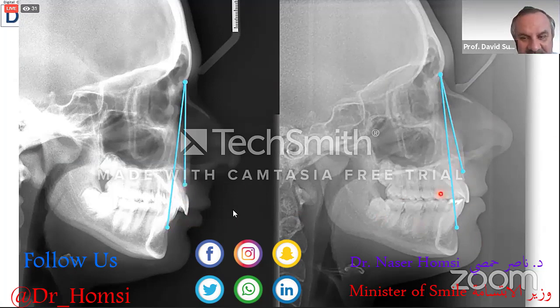Intrusion of the upper incisor with the stainless steel curve of Spee, protrusion of the lower incisor. If you produce protrusion of the lower incisor, and remember in many techniques like the miraculous brackets, passive self-ligating brackets, do you understand what is the technique we are using? You can see in a lot of patients, the lower incisor at the end of the treatment presents a very marked protrusion. Why? Because this technique has very bad control of the friction.